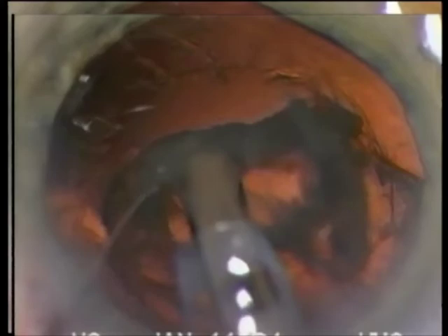The second instrument is used to feed the material to the phaco tip. For removing rigid epinucleus like this, I will use either the Memory 1 setting with Pulse Mode or Memory 2 setting. In this case I'm still using the Sinsky hook, but if there is positive vitreous pressure, I will switch at this point to a straight cyclodialysis spatula.